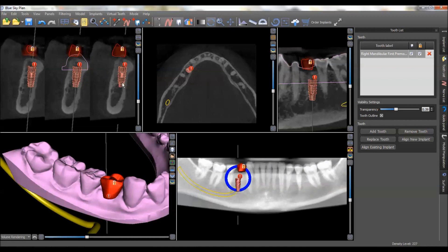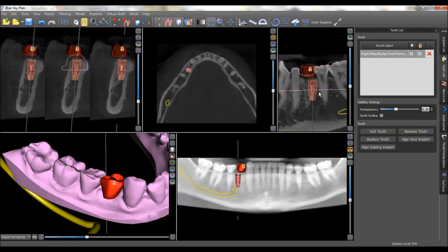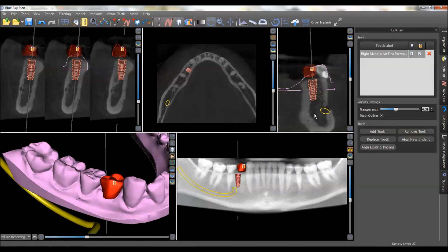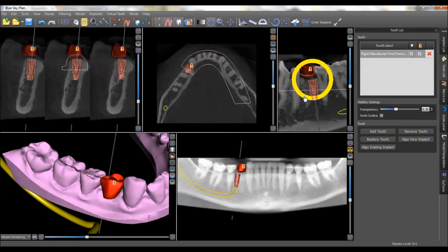You'll notice this little exclamation point came up — that's telling me that I'm too close to the nerve, as you see down here. And as we move that on up, we don't have that problem anymore. You'll do the dance of looking at this in all dimensions and trying to place it according to the best surgical and prosthetic position.